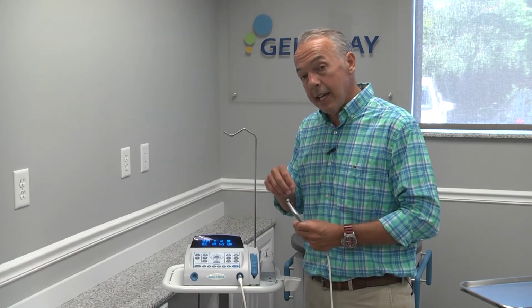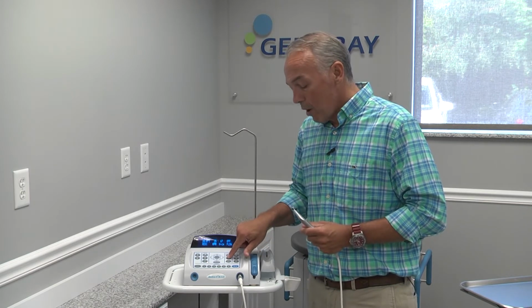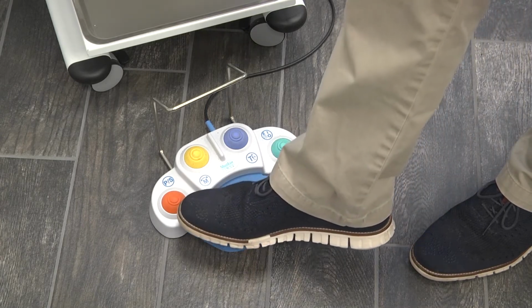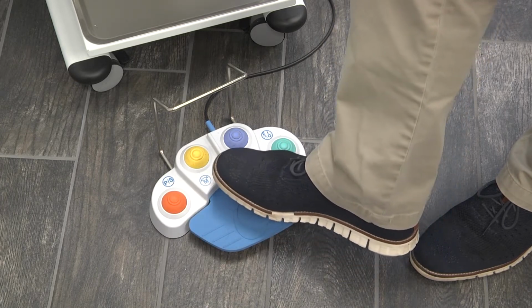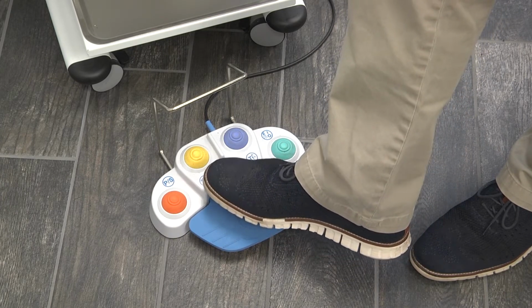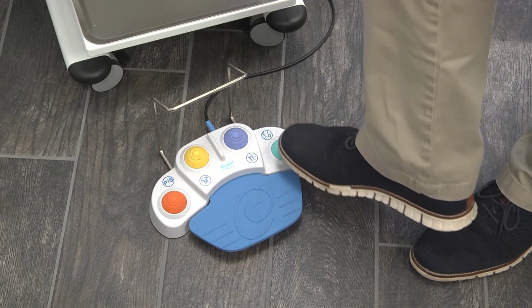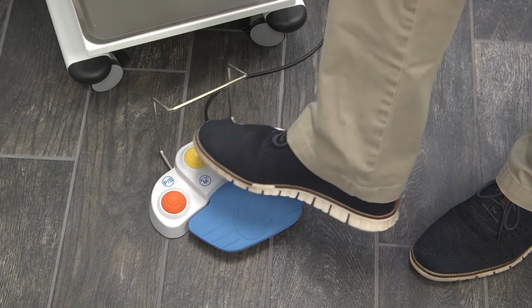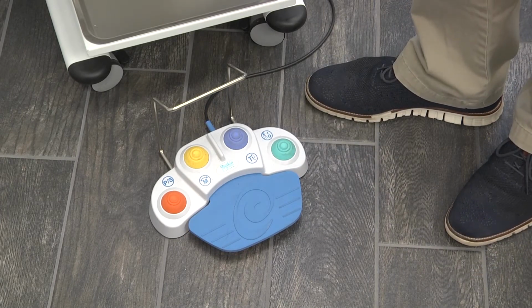In the event that it's not taking the implant out, you can increase the torque by pushing this up arrow button, or you can use the foot pedal. The foot pedal is very nice and easy to use. It comes all color-coded. The orange button here is for the presets. I can go 1 through 6 on the presets by just pushing this button. The yellow button is to go either forward or reverse. The purple button is for the Newton centimeters of torque. I can increase the torque. And the teal-colored button is for the irrigation. So everything's color-coded here. I can do everything with my foot if need be, or I can use my hand on the console, whatever's easier for you.